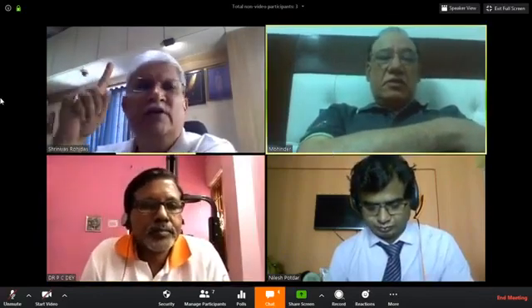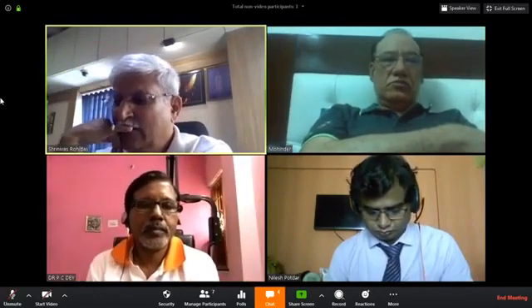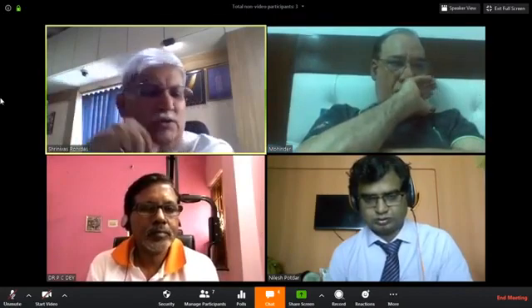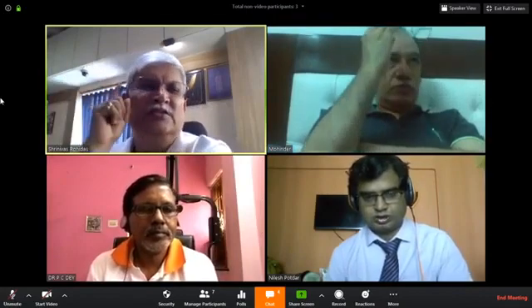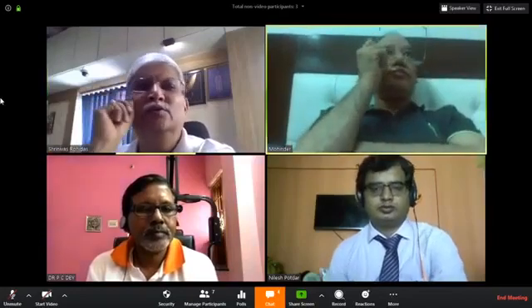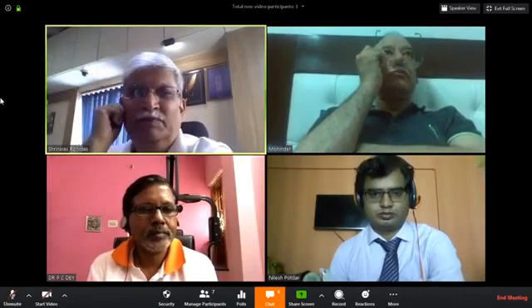Yes. There is a question from Dr. Vijay from Jaipur. What to do if a dural tear occurs? I will answer first, and then we will go to the other two speakers. In the initial stages, if there is a major dural tear, don't have ego, convert it to open and close it.